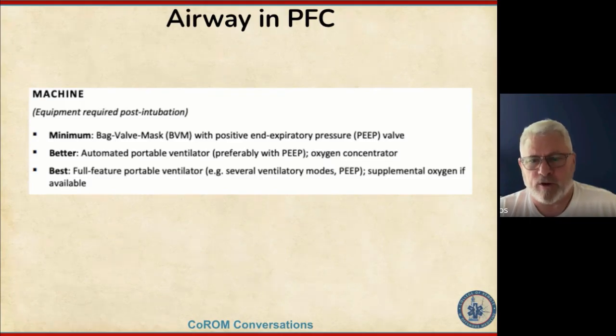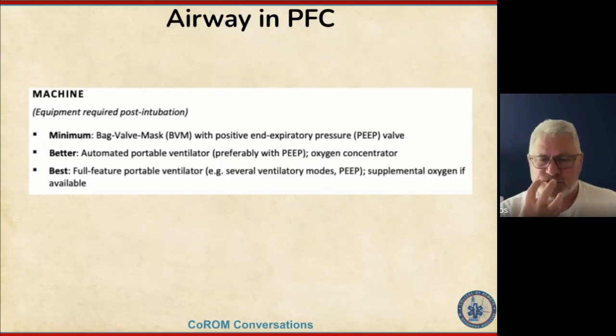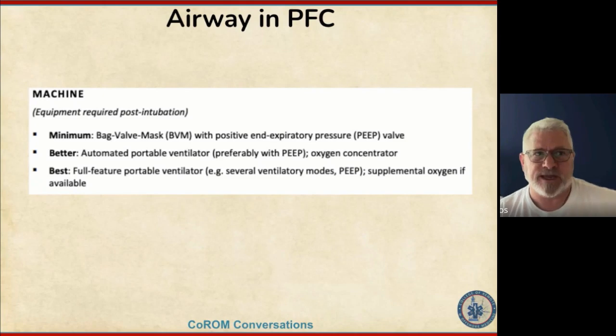In your training, when you're doing airway stuff, work with another medic, have them put you in a proper position, the sniffing position. Make sure that you get a good seal with your BVM and you're able to maintain a good seal. And if that person is able to get a good C and E, which we talk about a little bit later, if they're able to get a good seal on an airway, you should hear the PEEP valve when you're exhaling through it. And how do you confirm that you have a good seal? You should listen for that audible exhalation through the PEEP valve.